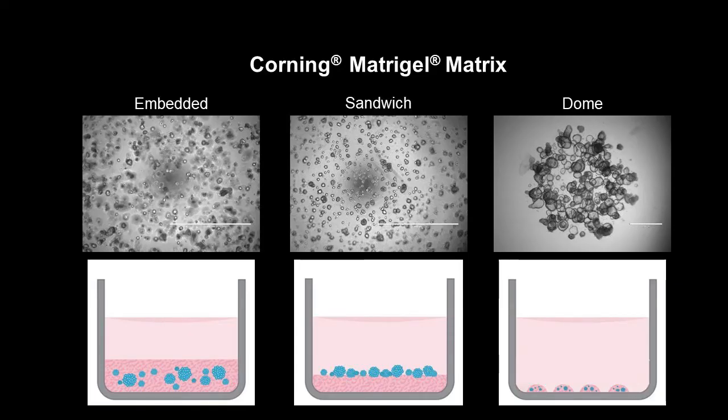Or you might be trying to do something that's more like mimicking an organ, for example, and you're typically working with stem cell models, and this is with organoids. And for that, you need more biological information. So you need something like our Matrigel in order to help give that information to the cells. And that's a scaffold-based method.